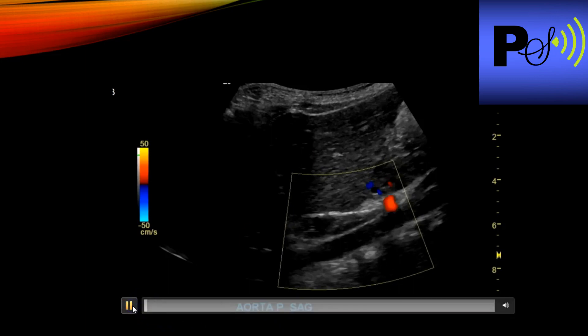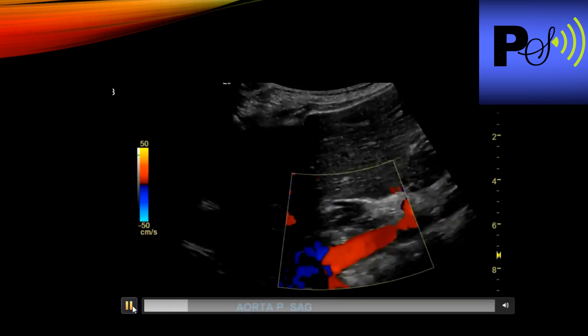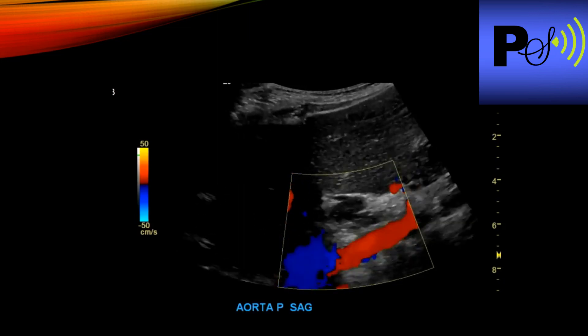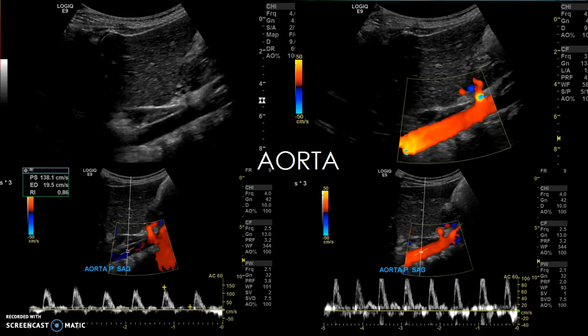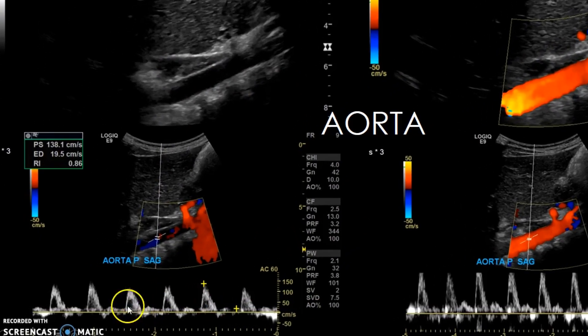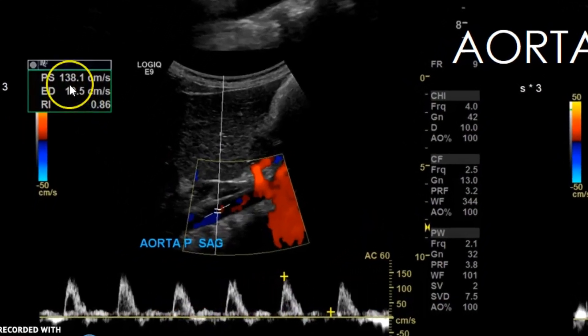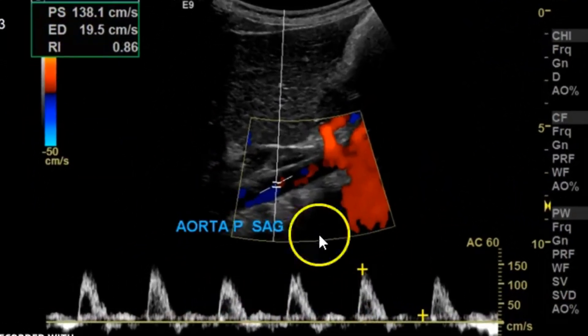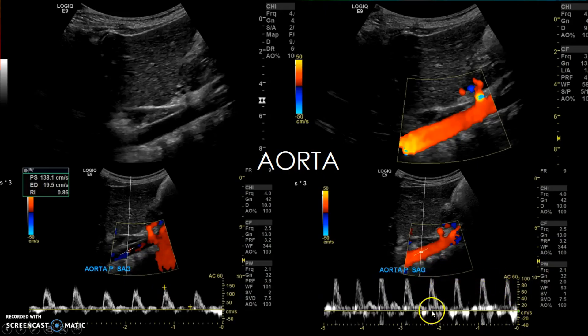When you begin the exam, start with the aorta. Take grayscale images, color images, and a spectral wave analysis. You can see a nice aorta waveform at 138 centimeters per second. Make sure your scales are set correctly — if it's aliasing, the scale is too low; if the signal is too compressed, the scale is too high. Sweep speed and scale must both be set correctly.